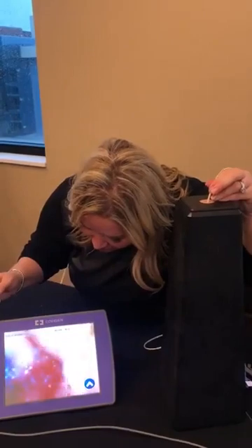Yep, you're pressed up against some tissue. Ooh, let's kind of move back. So you can see those ridges that are indicative that we're in the stomach.